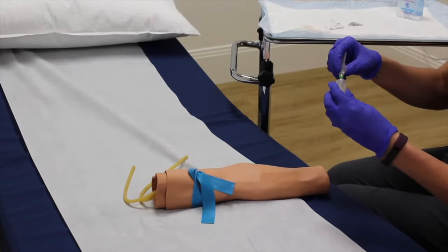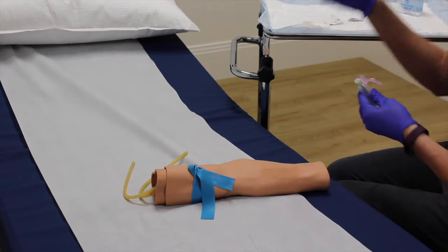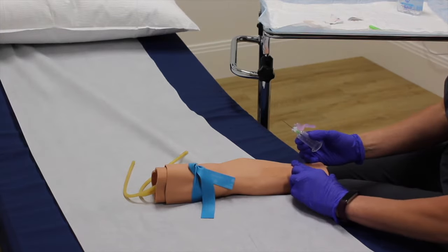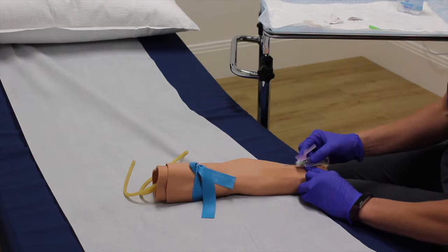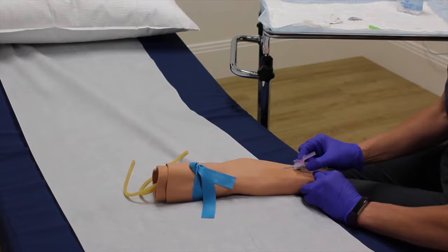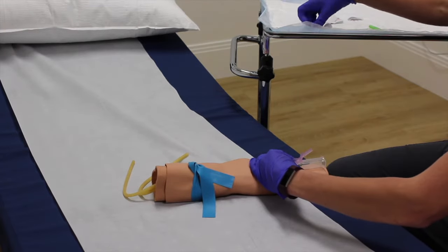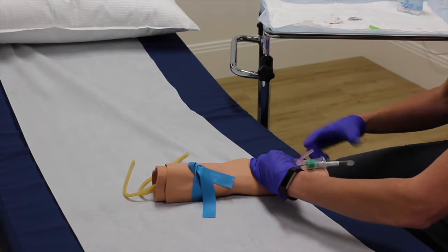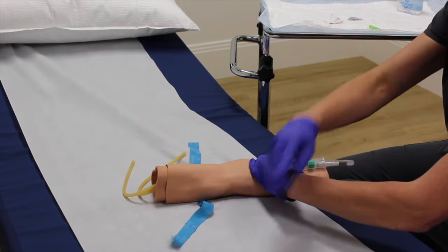Connect your Luradaptor to your vacuum container, then go ahead and pull that skin tight to secure the vein — going to be a little poke here. Once you're in, go ahead and secure. You're going to do your labs. Do not leave the tourniquet on for longer than 60 seconds, as it can ruin your red blood cells.